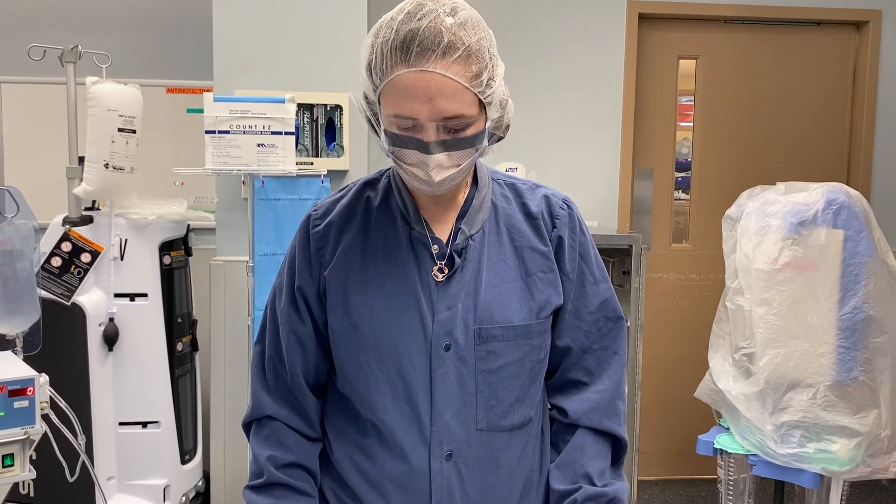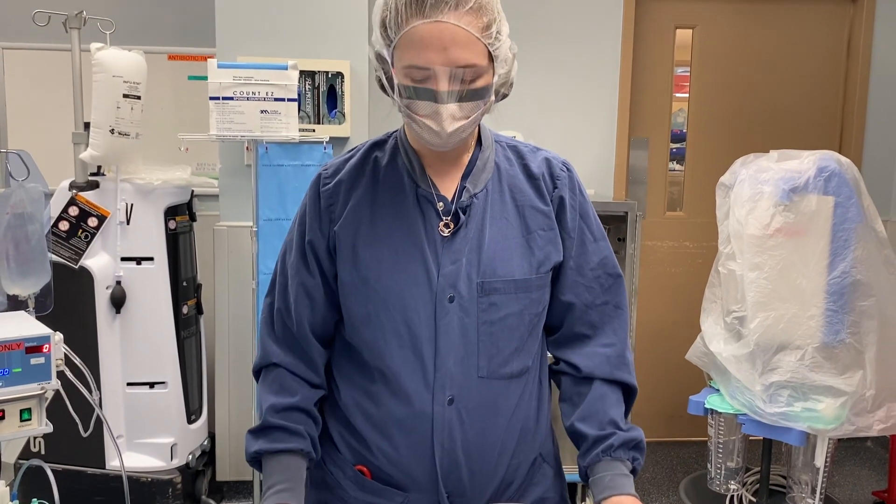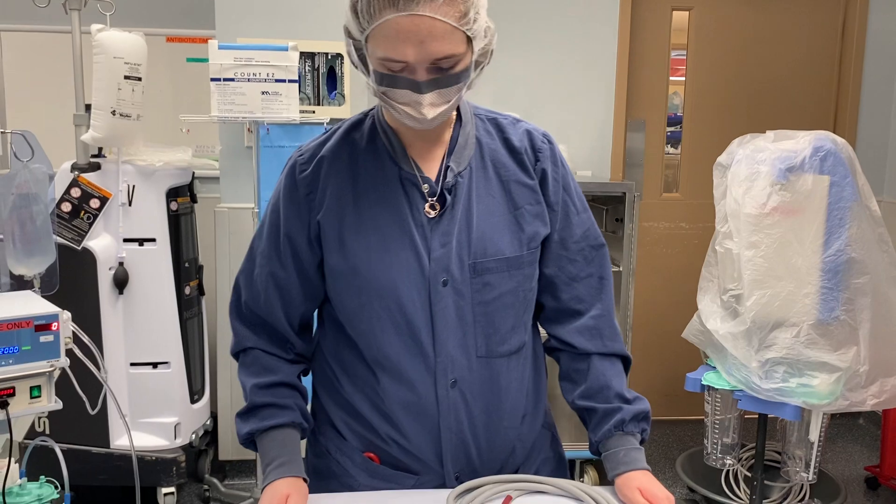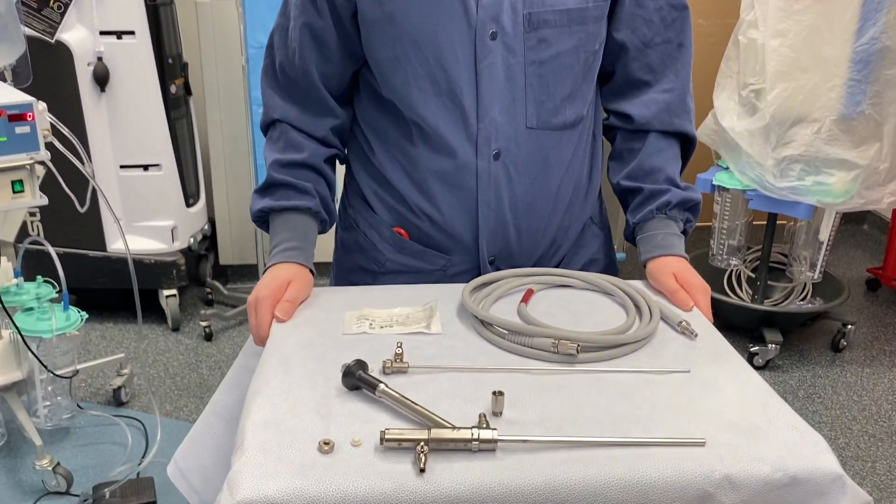Hi, we are showing you today how to set up the Hologic MyAshore scope as a surgical tech. We'll go through the different parts first.